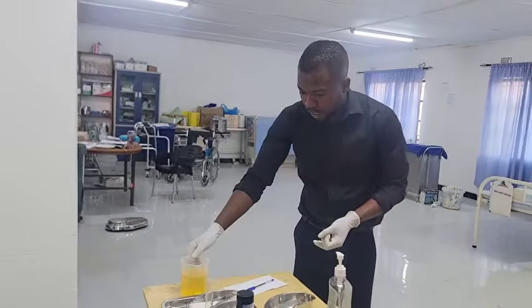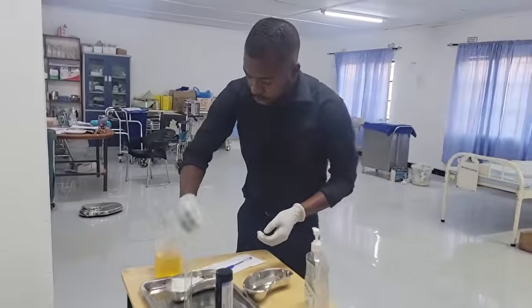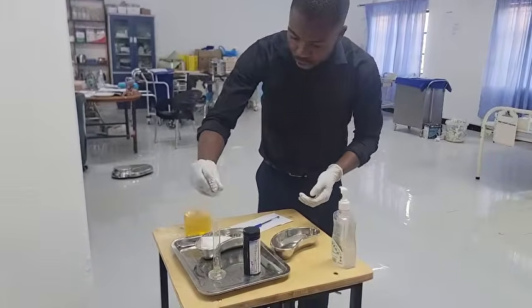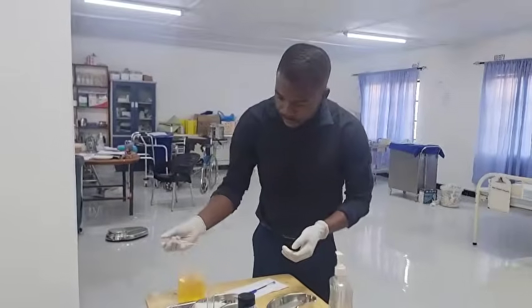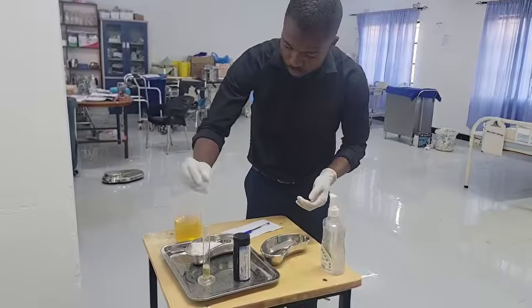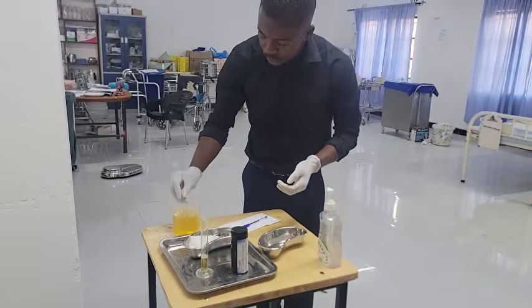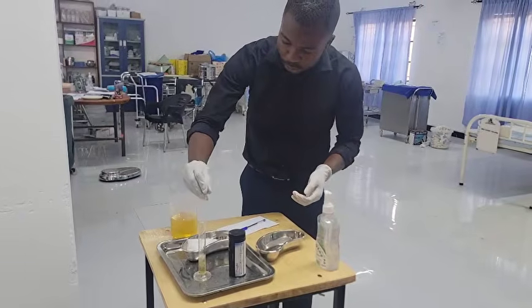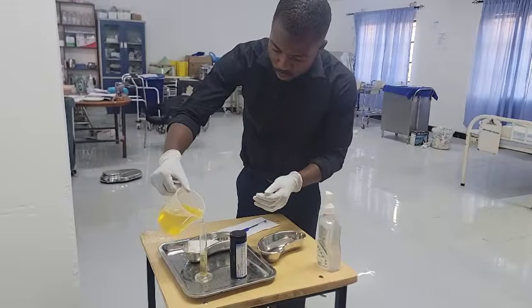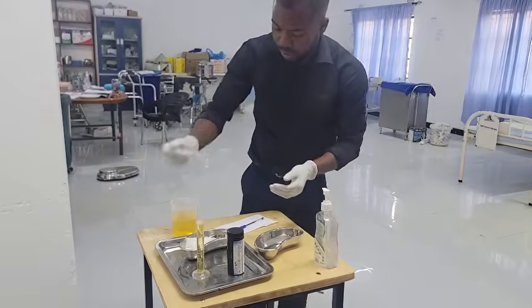The next thing you need to check is the smell. For the smell, you get a pipette, then you put urine in the test tube. You do this until it's enough. In this case, let me just pour, because we are going to waste a lot of time, but you are supposed to use this.